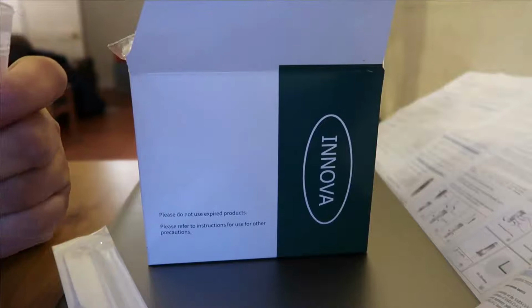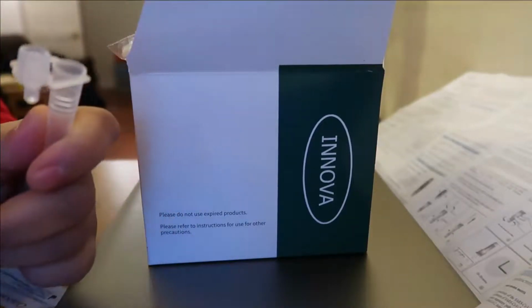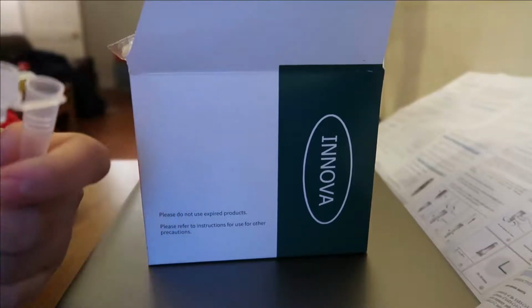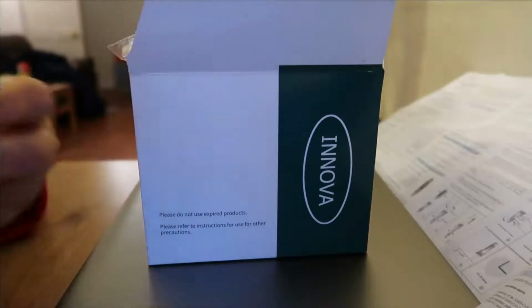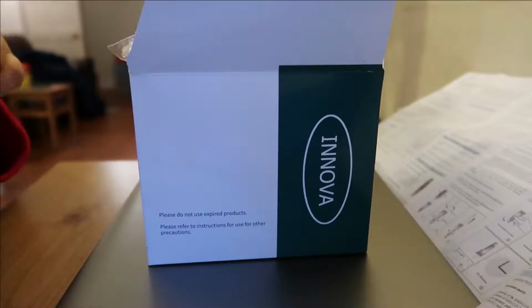So now I'm going to collect the specimen. I'm still holding the extraction tube in my hand with the extraction solution. Now I'm opening the sampling swab. See what I mean by you need to have a rack to put this in, but I don't have any. Sorry. Oh dear me.